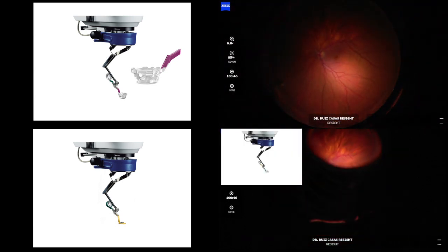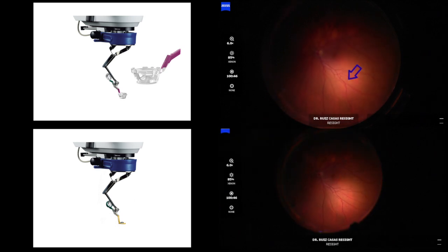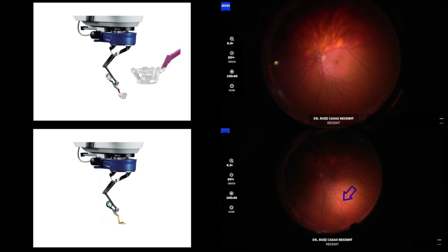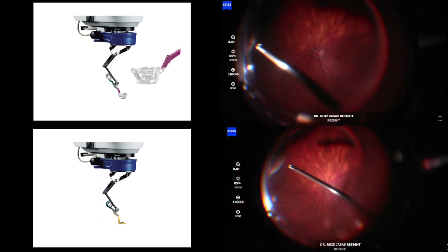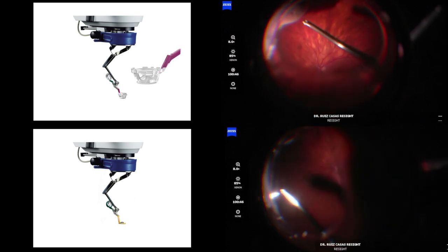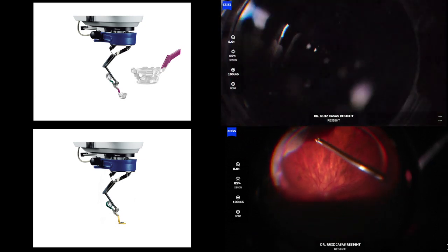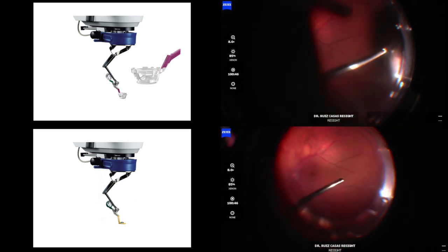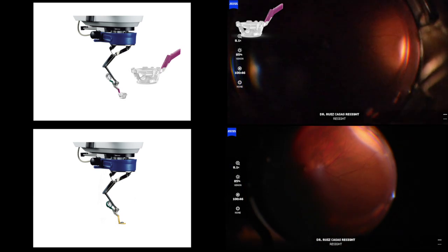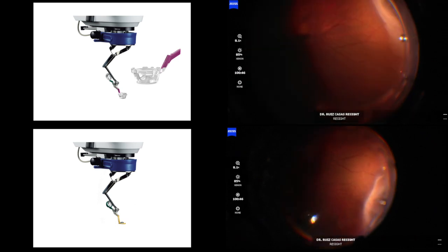You have this comparison between the ultra-wide and the normal yellow lens. The arrow marks the vessel crossing — as you can see, the peripheral view in primary position is larger with the ultra-wide. With indentation you can compare the reference; it is pretty similar, but also with the ultra-wide I have to indent a little bit less, so the deformation of the eye is smaller.